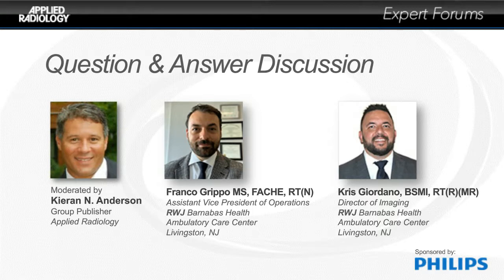So there is definitely a manual process and a more visual process, but then we do also leverage our technology and build templates in our scheduling system to ensure that mistakes aren't happening, and we also have to be cognizant of our add-ons as practices open up and stat procedures are requested. We have to make sure that we build some leverage in our schedule to compensate for these stat procedures, and that's what we do. We build in about 3 hours of time just allotted for stat procedures.